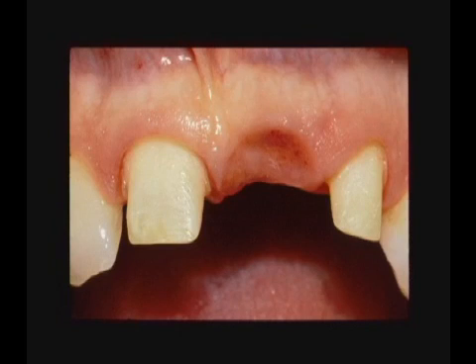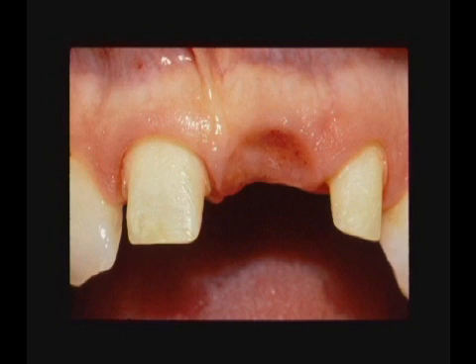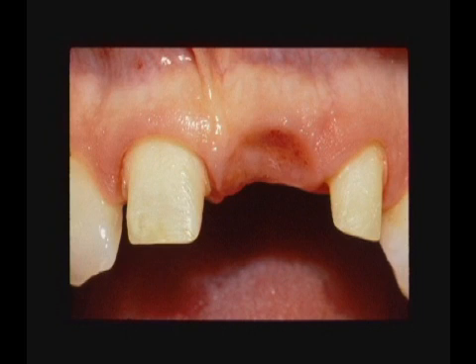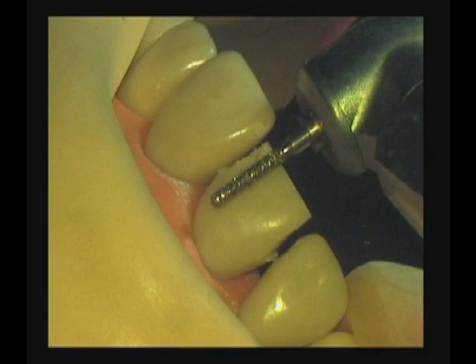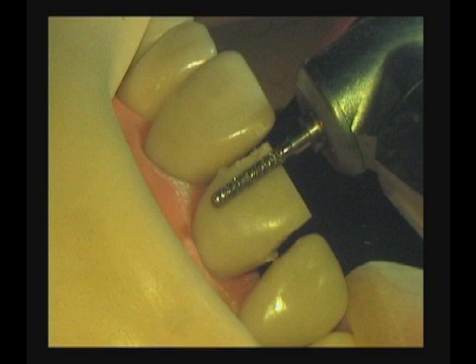The final preparations of anterior teeth should look relatively like this: about a half to one millimeter below the free gingival margin, rounded line angles, crisp external finish line, and the appropriate amount of reduction facially. In other words, it's very important that the burr be held vertically in the face.